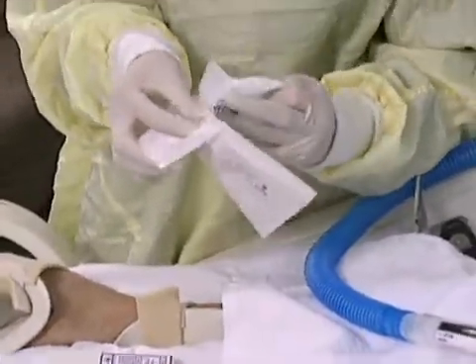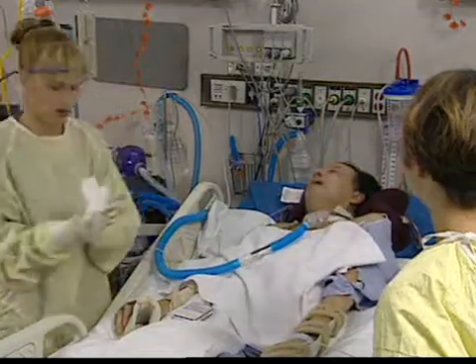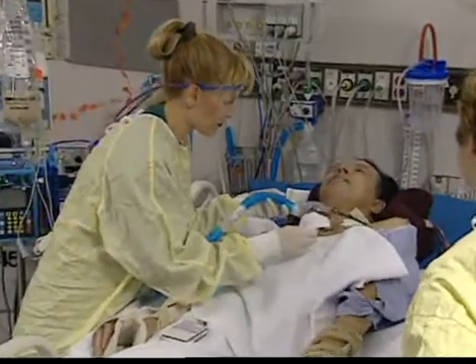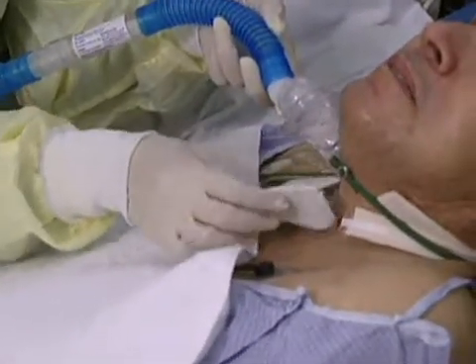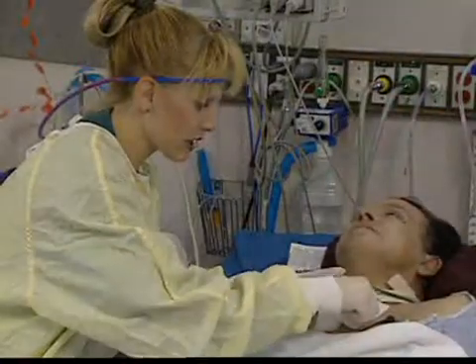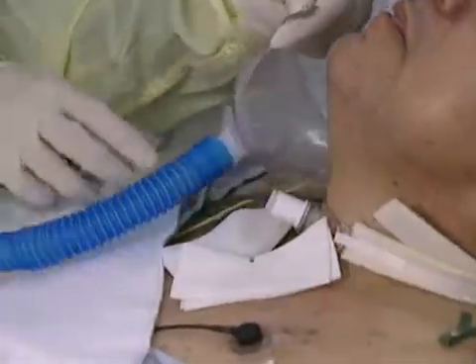And we do this 3 times a day to make sure that we don't get any cellulitis or infection or ulceration to develop at the trach site. And it's not a sterile procedure. So we lay the drain sponge like so. We'll be able to tolerate without this trach collar for just a moment and be able to see better, so you can see better how I do this.